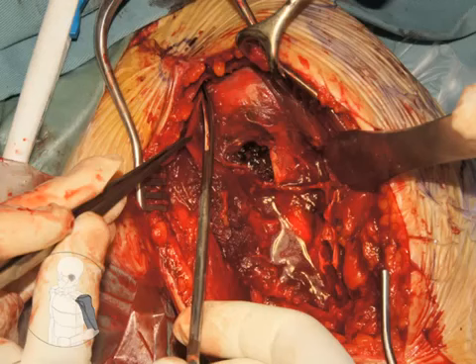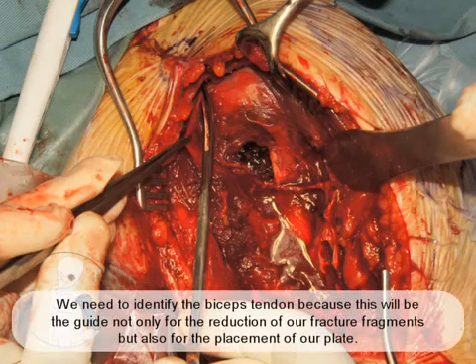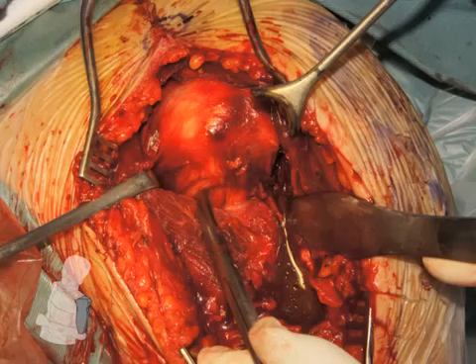The capsule needs to be advanced anteriorly. We need to identify the biceps tendon, because this will be the guide not only for the reduction of our fracture fragments, but also for the placement of our plate. We need to, once again, identify the biceps tendon.